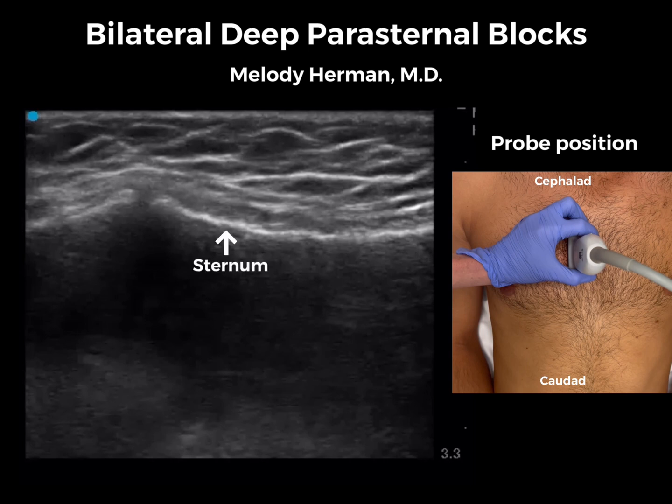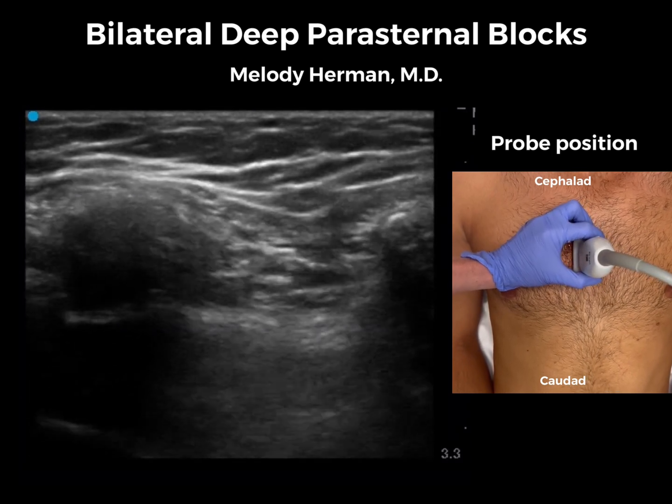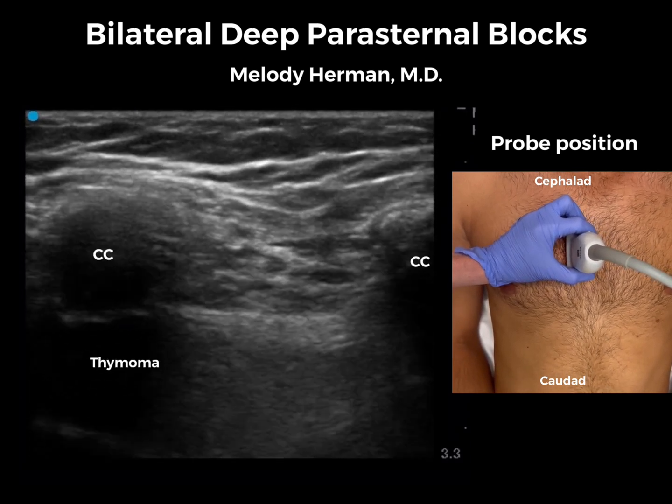We'll start with the ultrasound in the sagittal orientation over the sternum and slide laterally until the costal cartilages appear. Here, just right of the sternum, we see pec major, internal intercostal muscle, and somewhere down here is the transversus thoracic muscle.